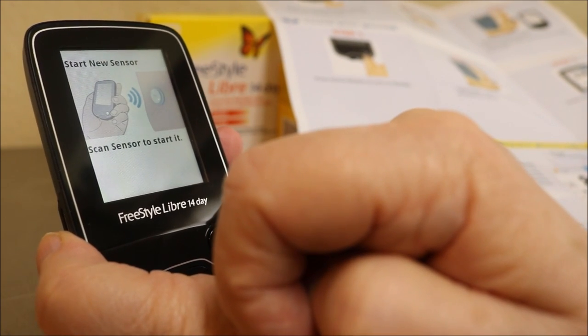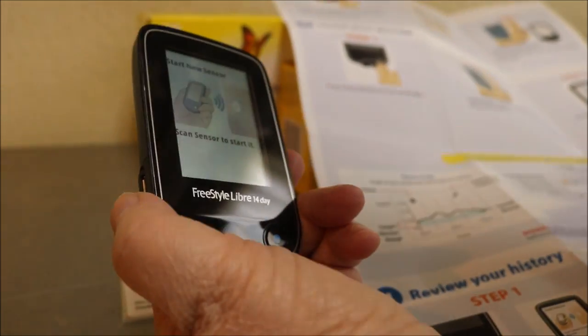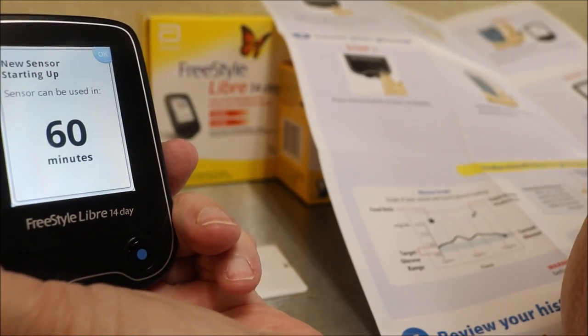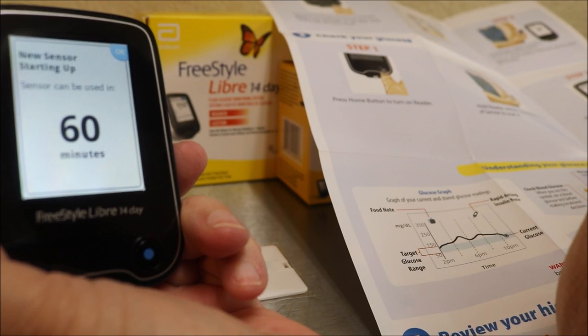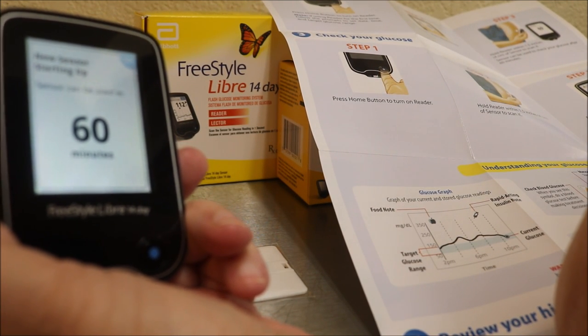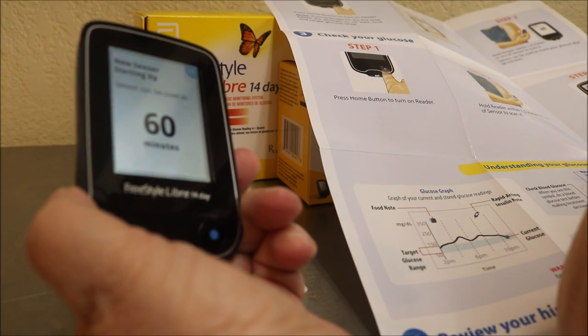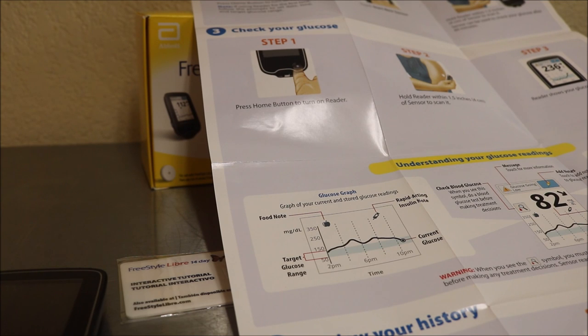Scan the sensor to start it. Now when 60 minutes is up I can start doing my blood sugars. Isn't this exciting? Hungry will be impressed — I didn't have to call him at work 75 times to help me.